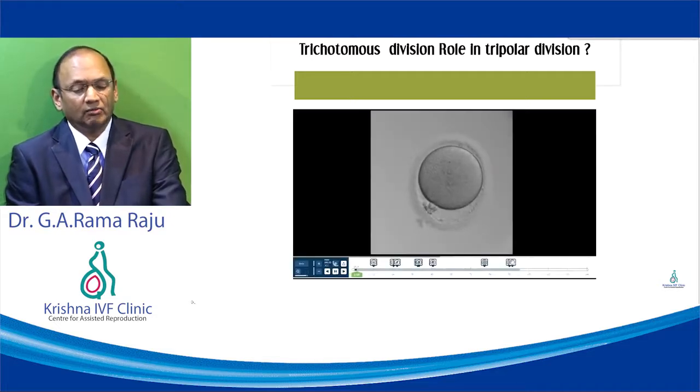It's the same video wherein this is the timeline at the bottom, this is the 2PN.